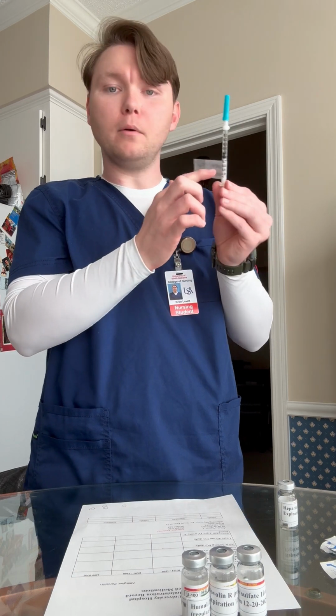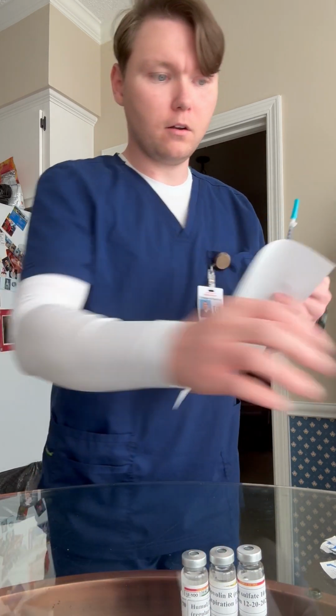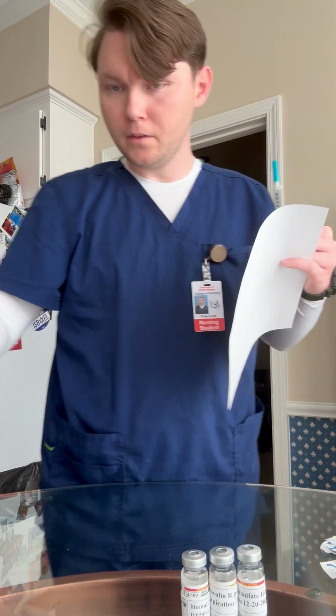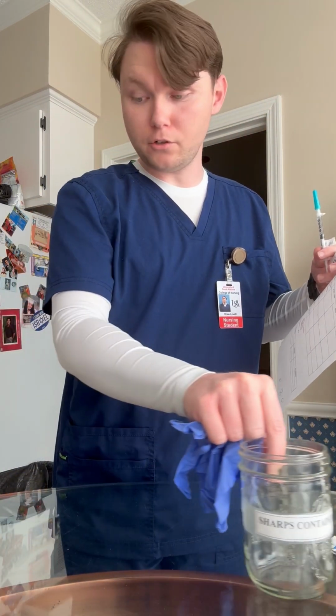This is going to go in my syringe, and I'm going to be careful not to cover the area. I'm going to put it below my plunger so that I can still see the amount of medication that I do have in my syringe. Okay, so I'm going to take my vial, my syringe, my MAR. Gonna get me some gloves. Okay. All right, I'm gonna go to Mr. Jones's room. I got my sharps container.